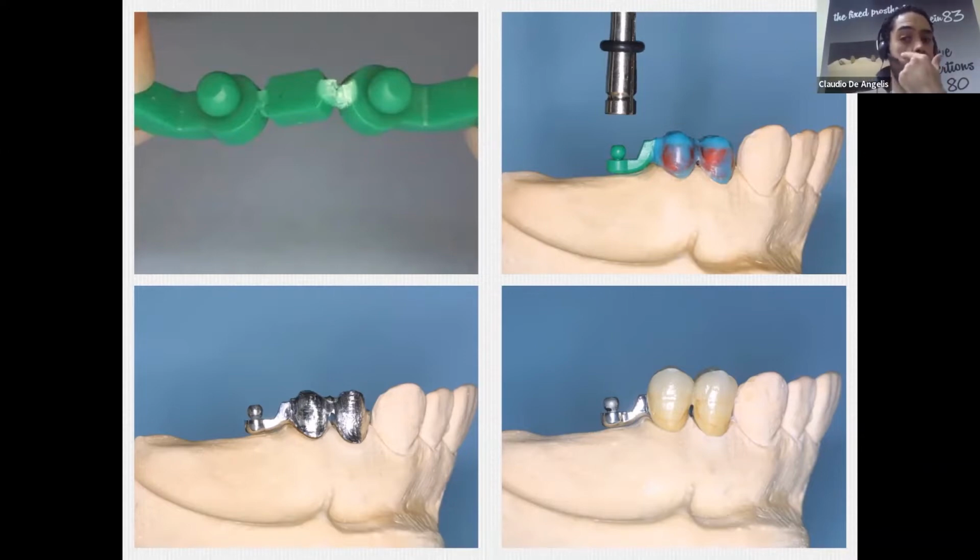This said, you just connect it to the crowns, paying attention to this kind of flat surface. It's like a threshold, it's like a seal, call it as you want. The idea is that you need to preserve this part because it has a strong meaning. Sometimes, even in Italy, I noticed that dental technicians cut this arm because they think it's too long, it's too far from the crowns.